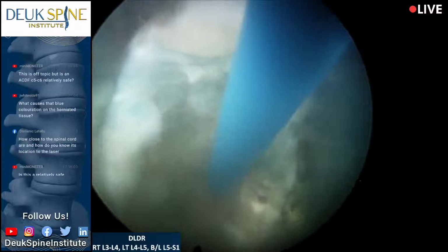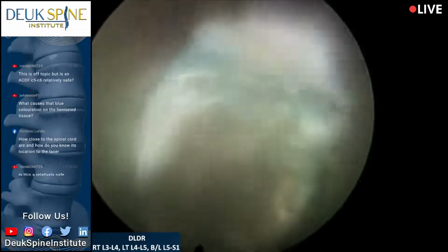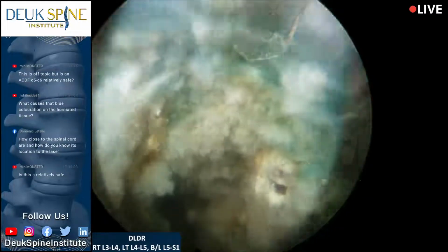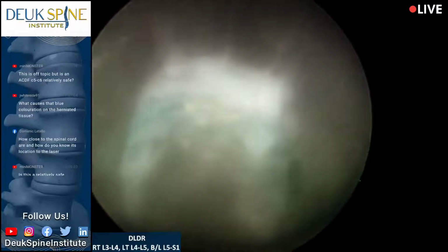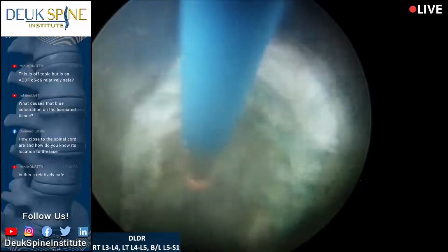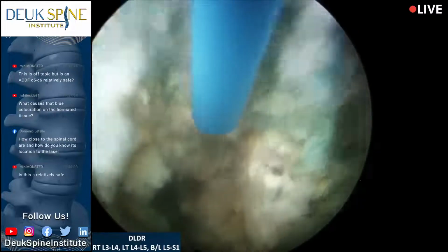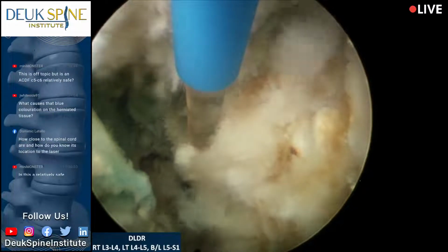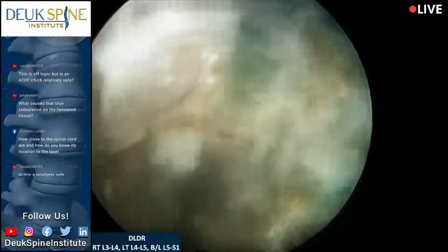We have another one from YouTube. Sure. What causes the blue coloration on the herniated tissue? Yeah, great question. So what causes the blue color down there? We inject the blue dye earlier in the surgery. If you rewind and you go back, you'll see. And that blue dye stains one thing and one thing only, and that's degenerated herniated disc. So to have a herniated disc, let's just say you have a herniation today. It happens right now. Then if I put this blue dye in there, it won't stain anything blue. The herniation will be white.